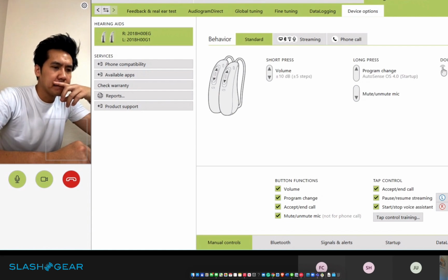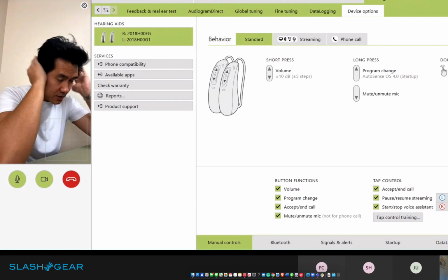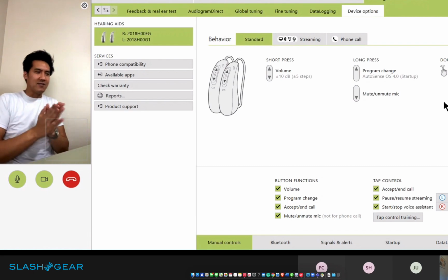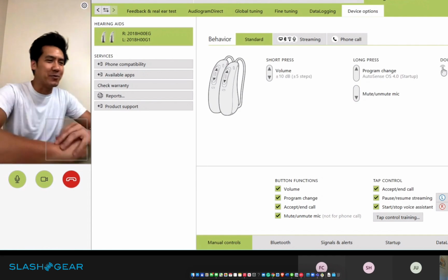Okay. And I adjusted your what we call whistle block. I adjusted that to a stronger setting, so that's okay. Oh, that's great. So you should be good to go. Fantastic. Thank you so much. This was a great experience. This is awesome. I know it's been a long time coming to get this walkthrough, but I love it.